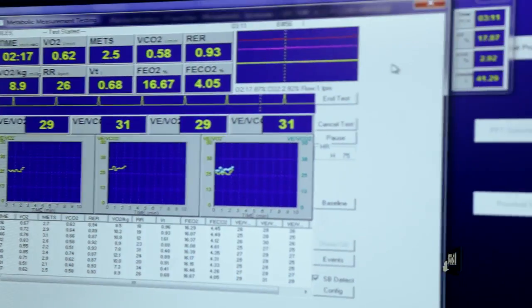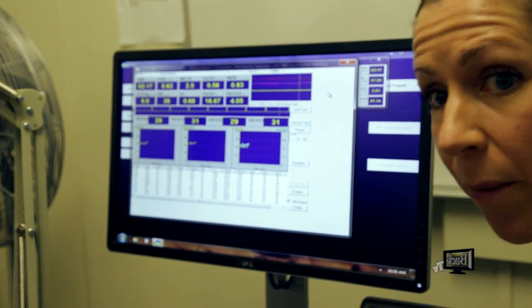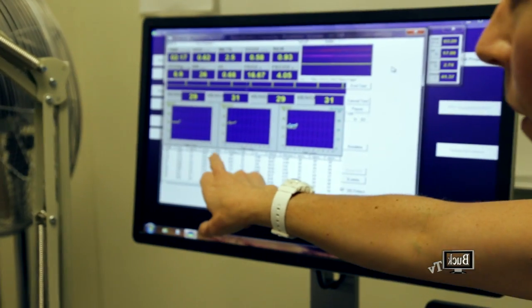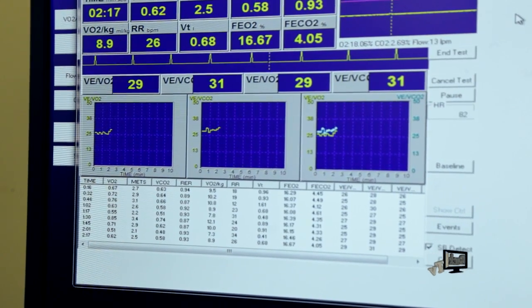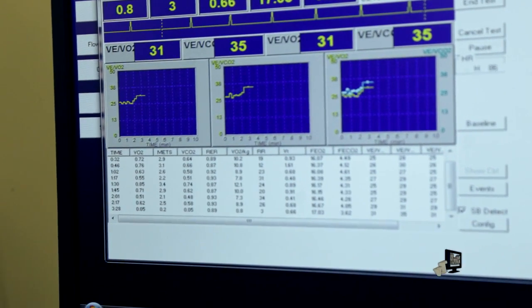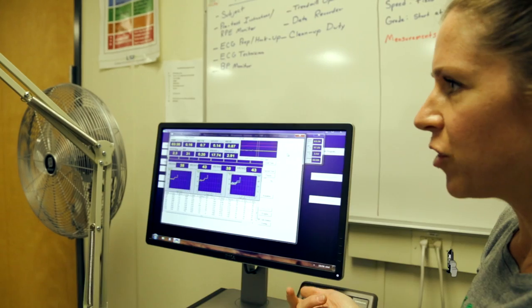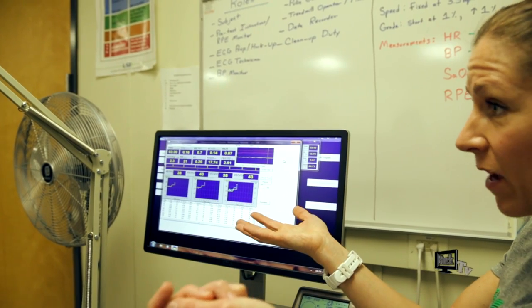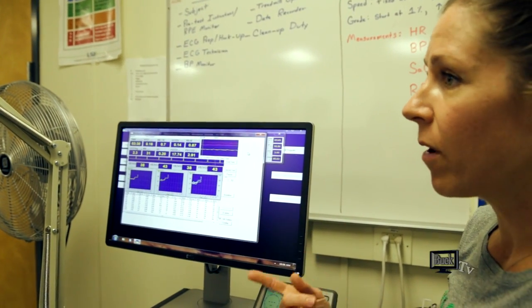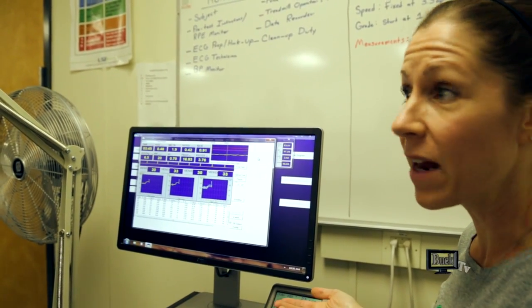All right, cool. VCO2 is the volume of carbon dioxide produced. So remember, RER, you guys remember we talked about RER? So this will show us his RER throughout the whole test. So you might want to come over as he's going and take a look at that. RER is a ratio of volume of carbon dioxide produced to oxygen consumed. So right now at rest, the pressure should be off your nose now. He should be consuming a resting amount of oxygen, but not producing a lot of carbon dioxide, right? So the ratio is much lower than 1. As he approaches maximal exertion, carbon dioxide produced is going to start to rise relative to oxygen consumed and approach 1.0. Usually we look for about 1.0 to let us know that he's starting to hyperventilate. We're probably, again, getting close to the end of his test.